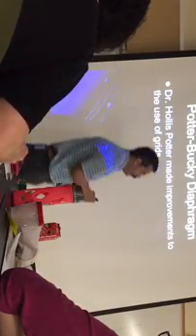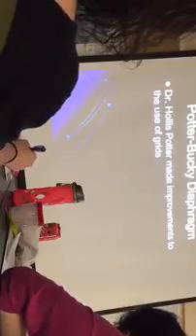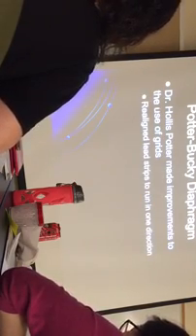All right, so what is the Potter-Bucky diaphragm? The Potter-Bucky diaphragm is the full name for the Bucky. That's what it's called, Potter-Bucky grid or Potter-Bucky diaphragm. And it's in honor of Dr. Hollis Potter, and he made great improvements to grids. Remember, Bucky had developed grids, he invented grids, but Hollis Potter made improvements to the grid, all right?